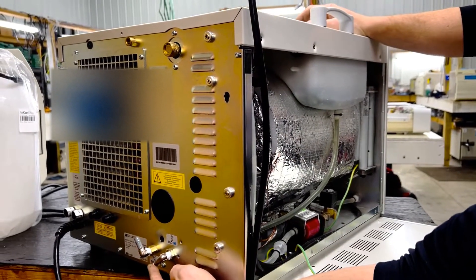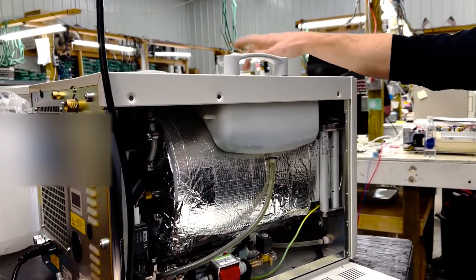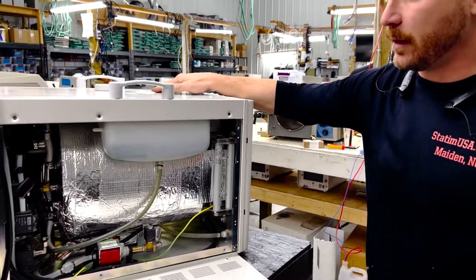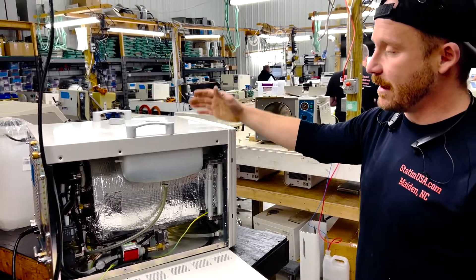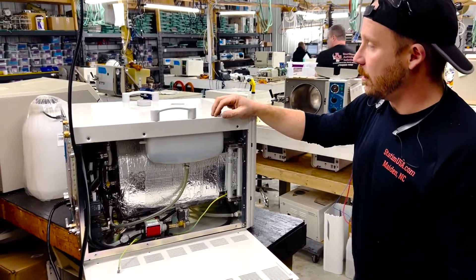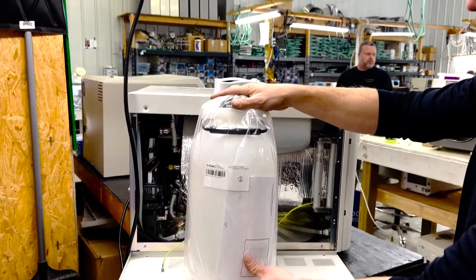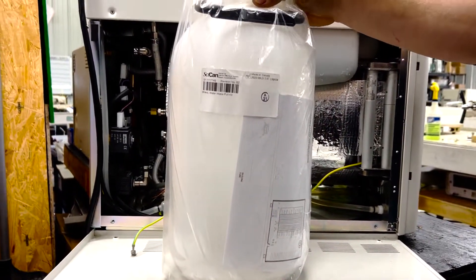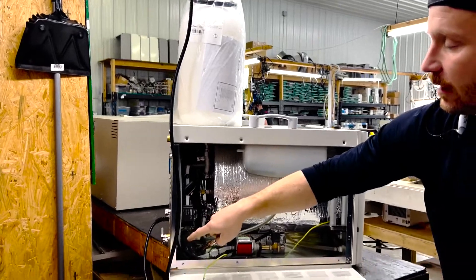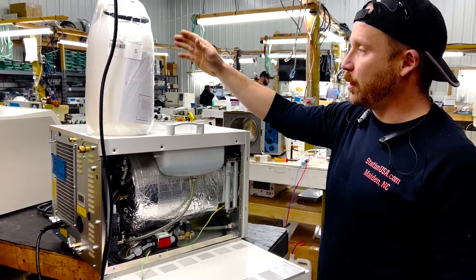This is also where it will fill from. If you don't have that option where it fills on the top — this is a 21V, it's pretty rare to see the fill from the top. In 17Vs and Bravo 17s, they fill from a water bottle. This is one of the water bottles — it's an intake pull kit and holds about two and a half gallons. You would put that up here or higher than the unit and plug it in back there. When the unit needed water, it would engage the water pump and pull it from here.